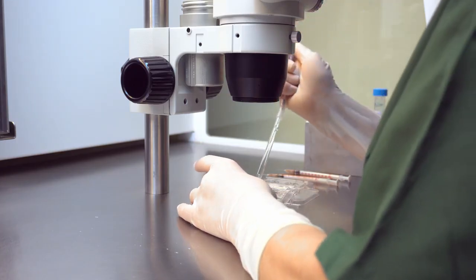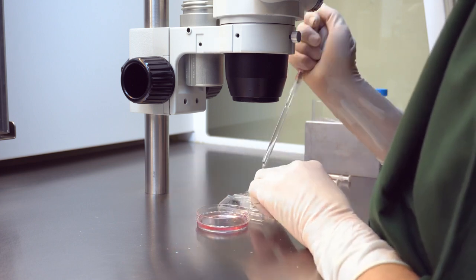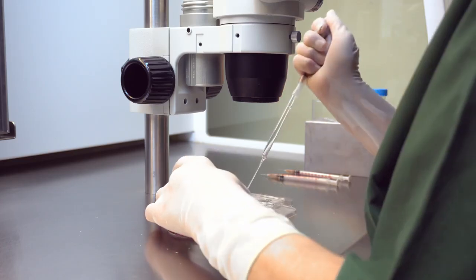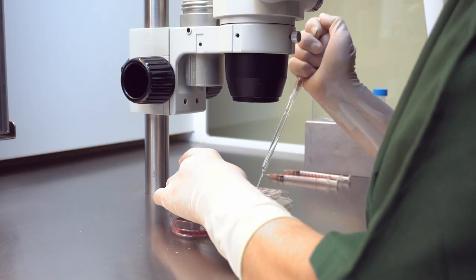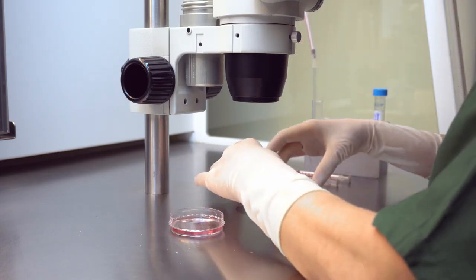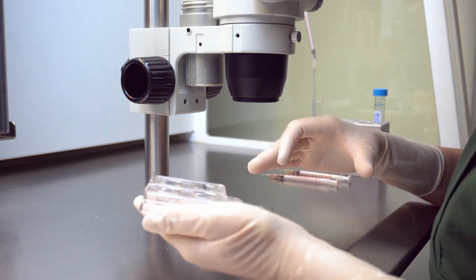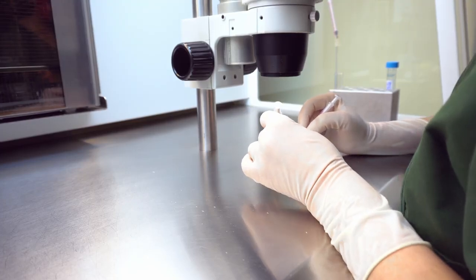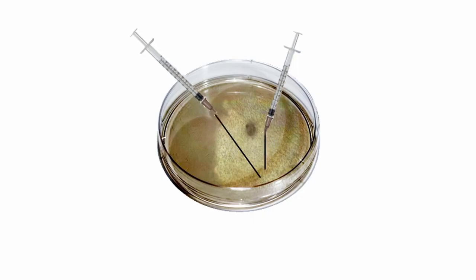It is noteworthy that the cumulus oocyte complexes do not undergo a denudation process prior to conventional IVF. Hence, they are inseminated with the sperm suspension directly, without subjecting them to hyaluronidase. After egg retrieval, cumulus cells are partially dissected by a needle tip and washed in buffered solution.